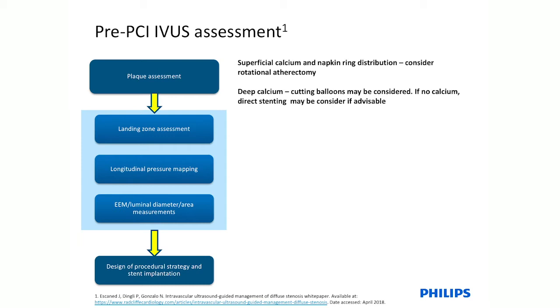On many occasions, when you have this particular pattern of calcification, you are not able to advance your IVUS probe completely through the stenosis. But that also provides some clues that you have an indication for rotational atherectomy or any technique that can address extensive calcification. We now have upcoming techniques like the use of shock waves for treatment of calcific stenosis, and there are other techniques in the pipeline.